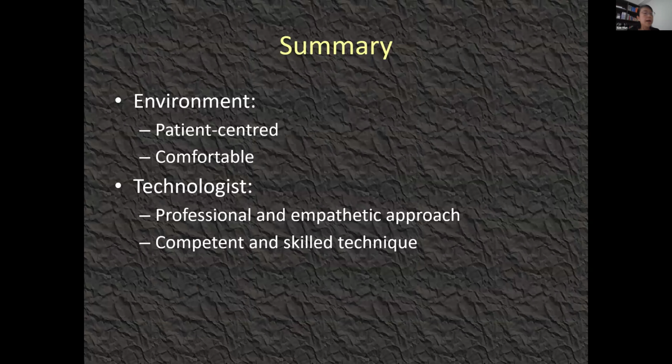So to summarize, optimizing mammography can be affected by various factors. When the environment is patient-centered and comfortable, patients have a better experience. Patients will feel more comfortable and more at ease. Technologists who are professional and employ an empathetic approach, I think, are very helpful to allay patients' anxiety.